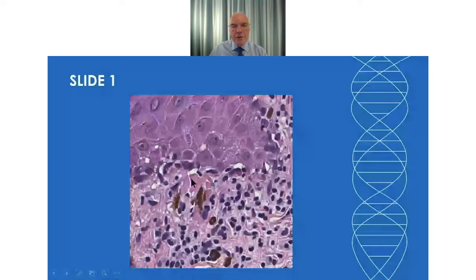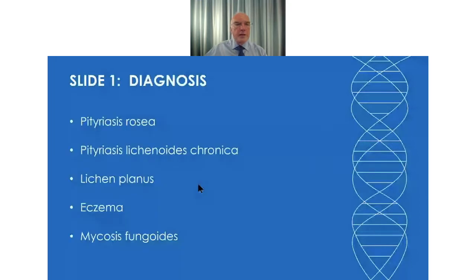We can also see in this photograph in the center there are some pink things, and I think these contain abnormal keratin, the word dyskeratosis. So these are probably basal cells that have become damaged by lymphocytic attack. See, lymphocytes are coming in and going around some of these cells, and these are probably the remains of dead cells, and those are the civatte bodies that are part of the thing to look for in this.